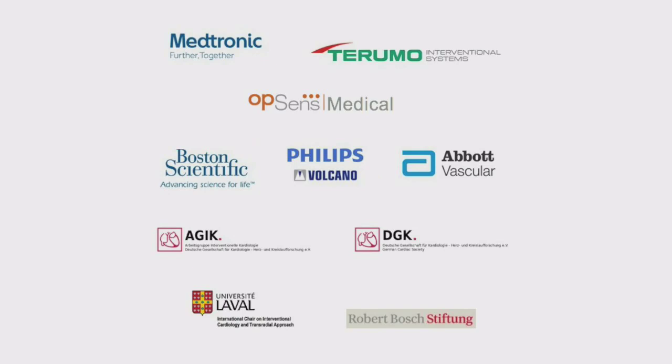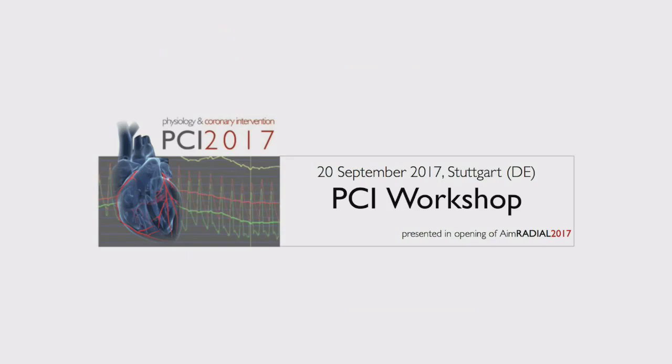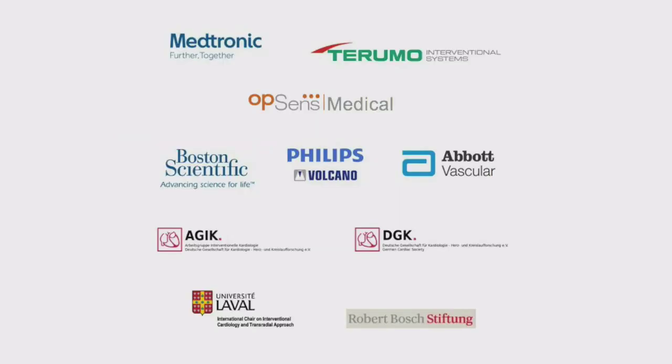In this case, there was 80% post-dilatation, so the stent was implanted at 14 atmospheres and then post-dilated at 16 or 17 atmospheres. So there is no more space that you can do something within the stent, and you still do not have a good FFR result. So for the people that measure post-PCI FFR, if you find a low value, what do you do, out of interest?